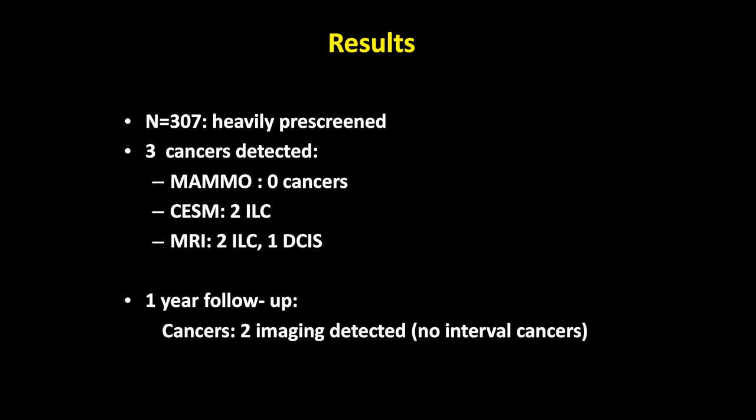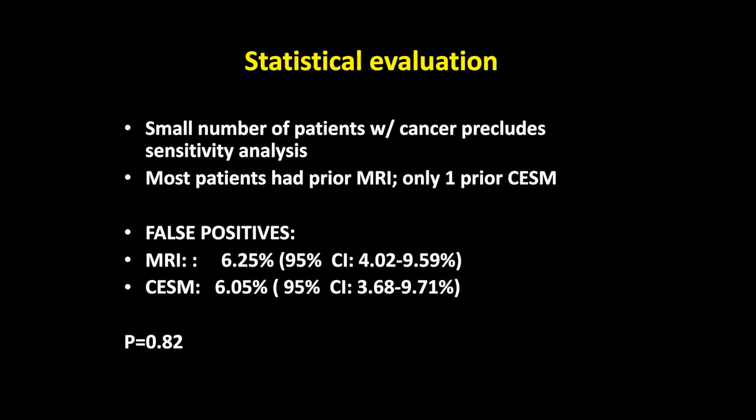We also looked at specificity. Now, keep in mind that these patients had multiple prior MRIs, which improves the specificity, whereas only 1 of our patients had a prior contrast mammo. Nevertheless, the specificity was equivalent, and definitely once you have prior contrast mammos, your specificity will improve.